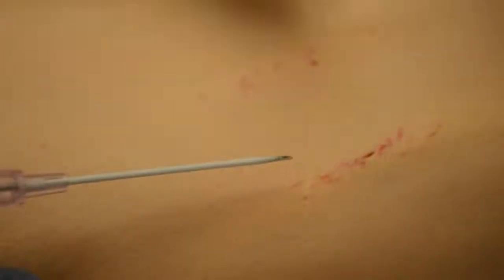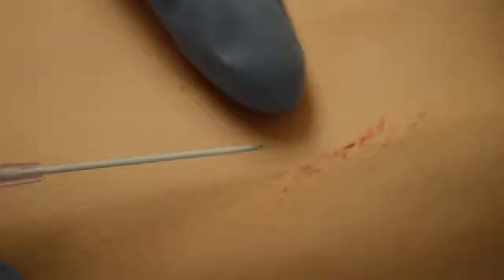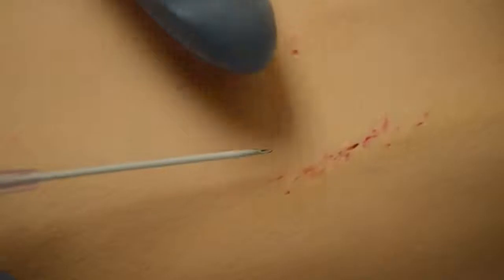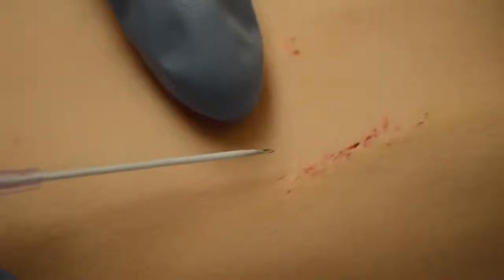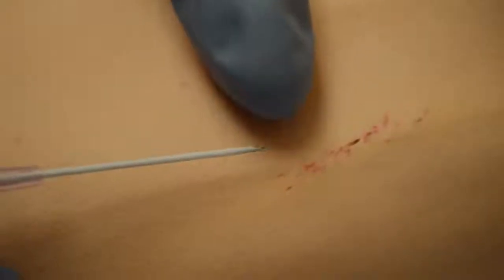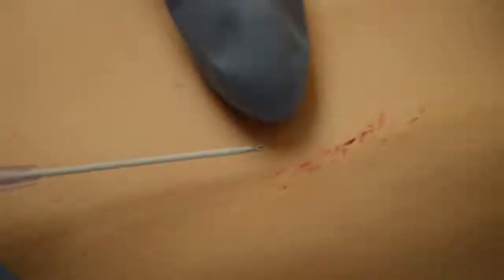So this is the bevel of the catheter, this small sliced out piece. This is the part that's going to give you the flash once you enter the vein. Seeing as the catheter is set back from the end of the bevel, when you initially get a flash, that's just this small part at the end receiving blood into it.